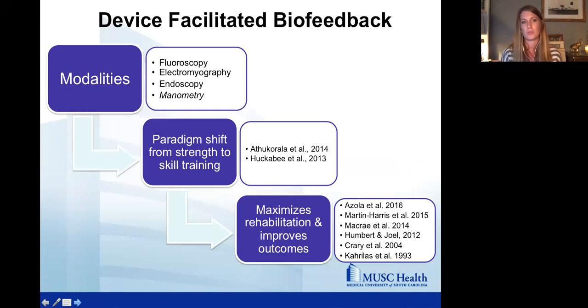And aiding those two is the feedback, the biofeedback portion, providing feedback against that task performance. So it's providing a mechanism for conveying cues regarding accuracy to improve performance of swallowing exercises and strategies. So all of those things combined, we are activating and working on motor activity, but now we're pairing it with more of a motor learning concept as a result of biofeedback facilitating that skill training. And this results in functional cortical reorganization, specifically for the recovery of the swallowing mechanism.